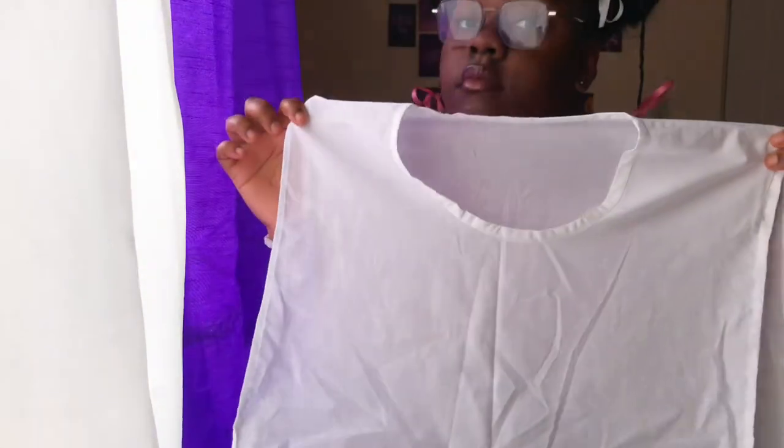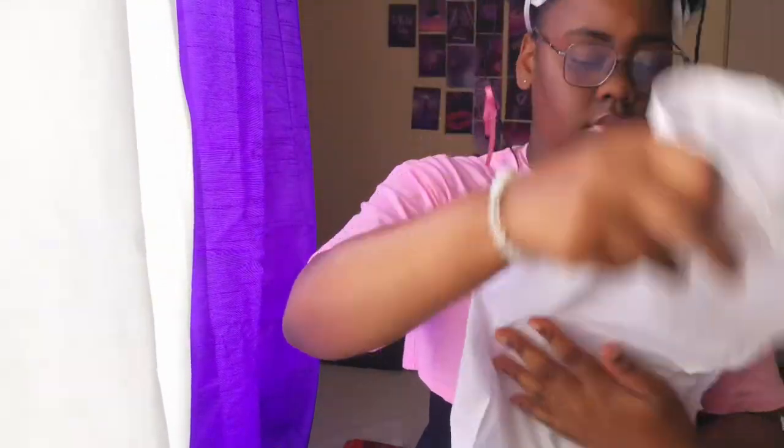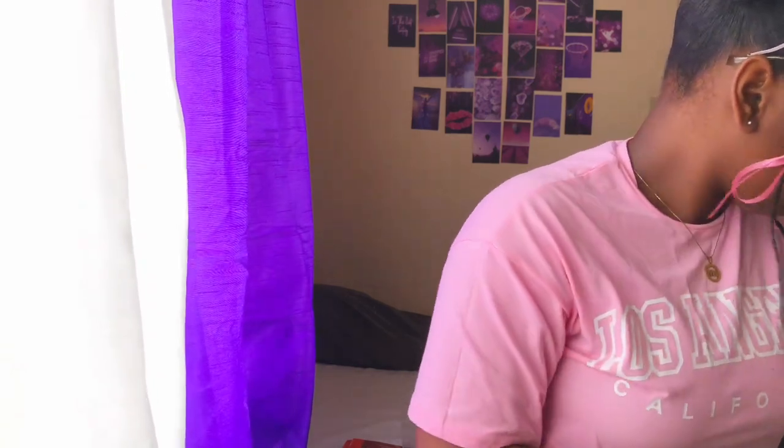Our first item is the apron. The apron is used to protect your uniform from getting soiled or dirty during direct patient care. This is a must when you're going to take care of your patients — you must wear it over your uniform so it does not get any form of dirt or soil on it, and to prevent any cross contamination between you and your patient.